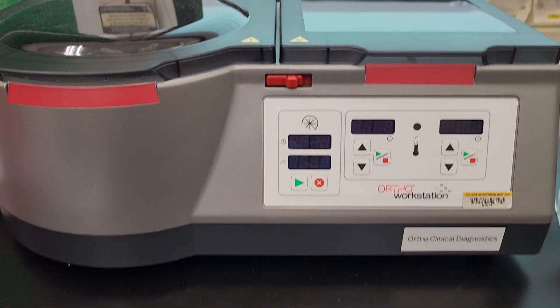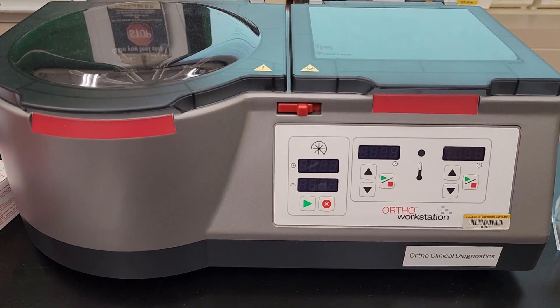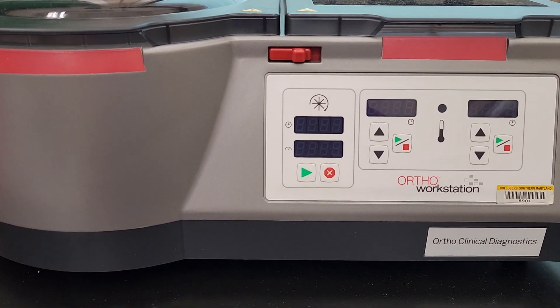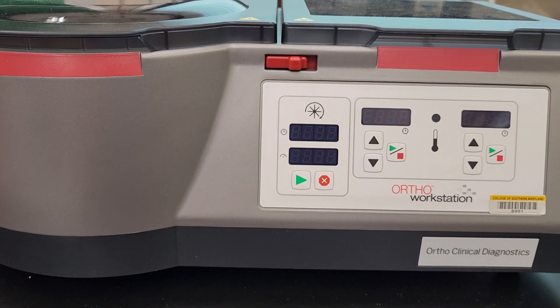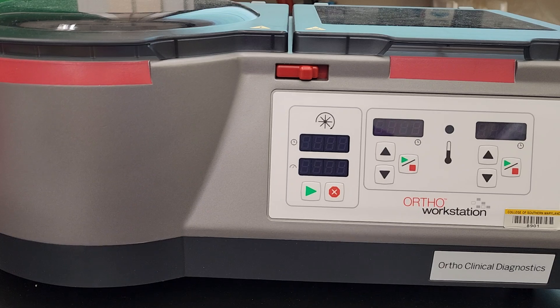Hello everyone. Today we are going to be using the Ortho Workstation. This is a gel analyzer. It's semi-automated. The first thing that you're going to do when you come in, just like a dry block, would be to turn this on.